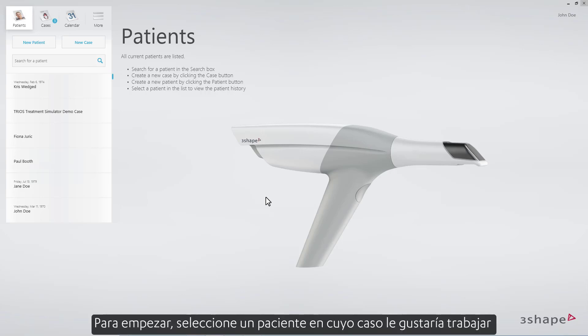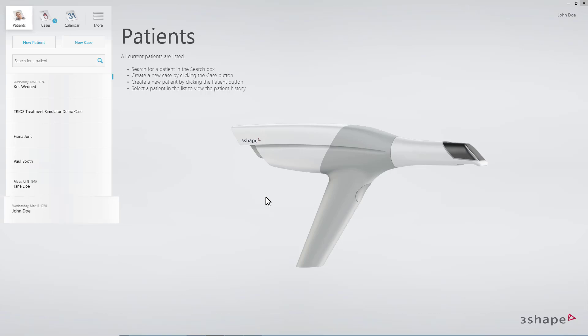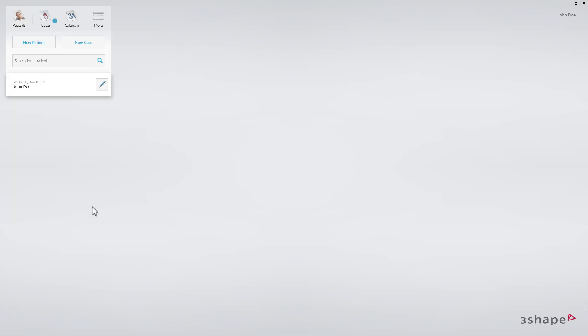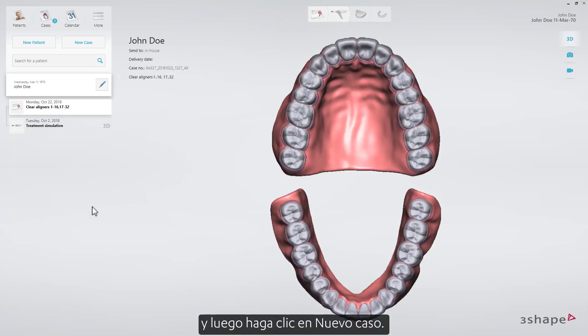To start, select a patient whose case you would like to work on, and then click New Case.